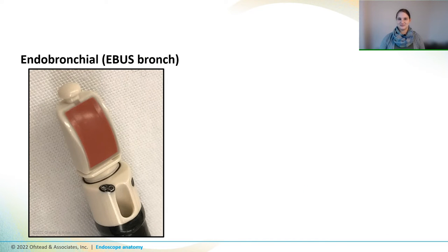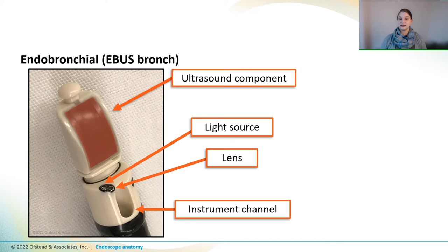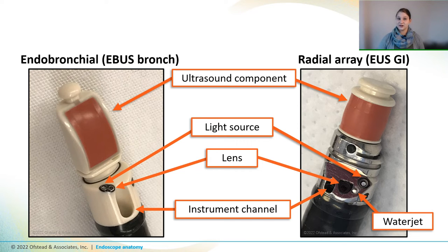Some endoscopes have ultrasound mechanisms on their distal ends. The EBUS, or endobronchial ultrasound, is used in the lungs. And the EUS, or endoscopic ultrasound, is used in the upper GI tract to provide real-time imaging and assist with aspirations and biopsies. Let's look at the EBUS scope first. The pink part on the distal end is the ultrasound component. And like other scopes we've seen, this one has a light source, a lens, and an instrument channel. Now when we look at a radial array EUS scope, it also has an ultrasound component on the distal end. And if you look closely, you can see a light source, a camera lens, and an instrument channel. And this one also has a water jet that flushes water across the channel to clean it off.